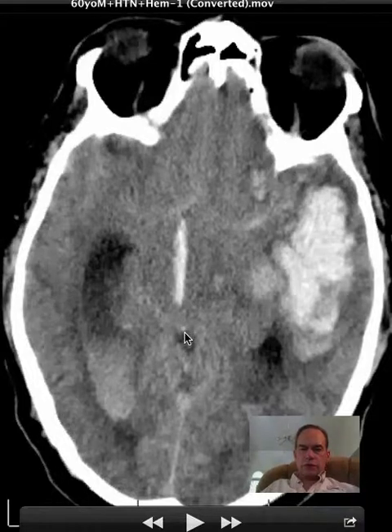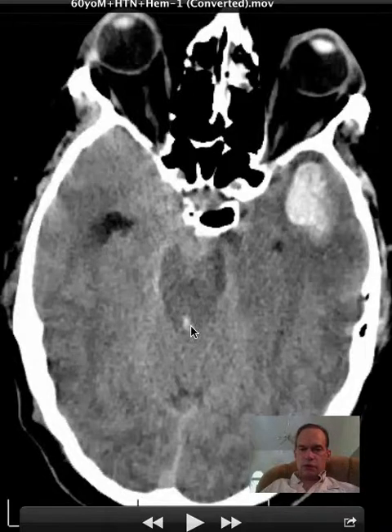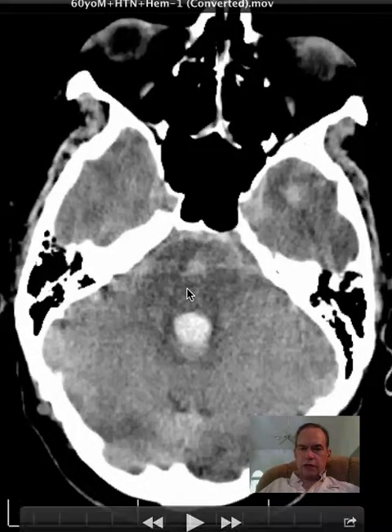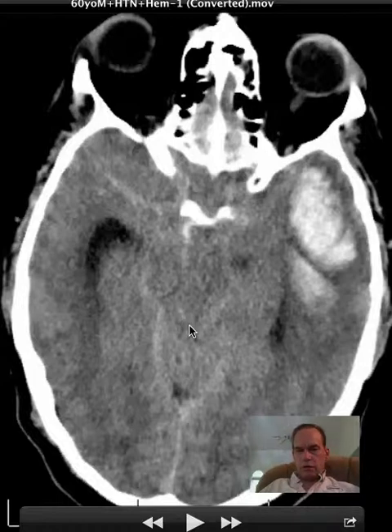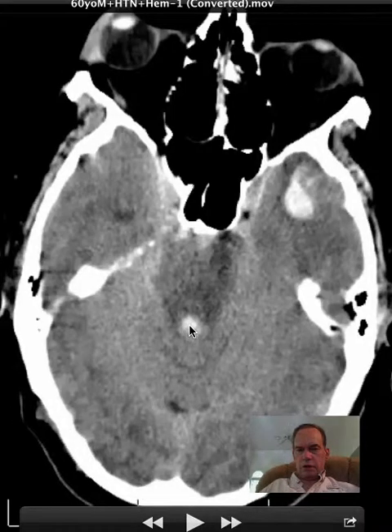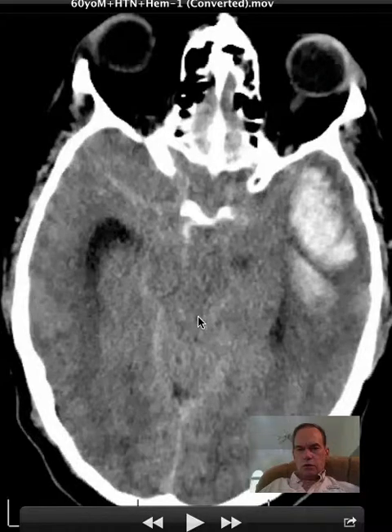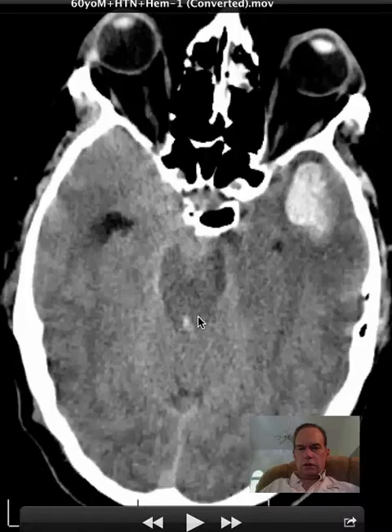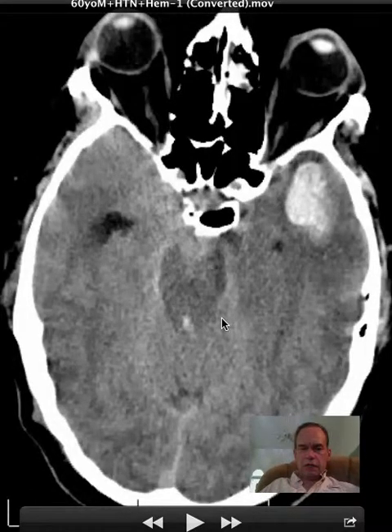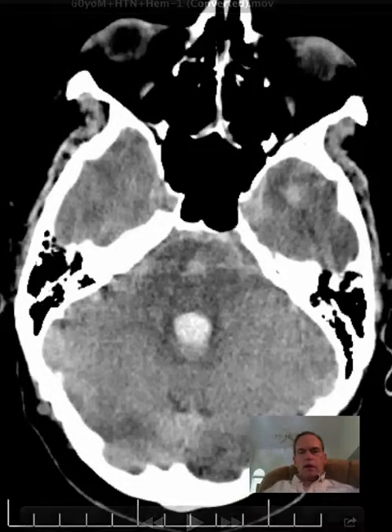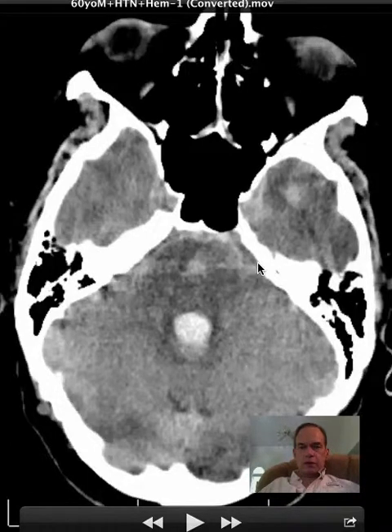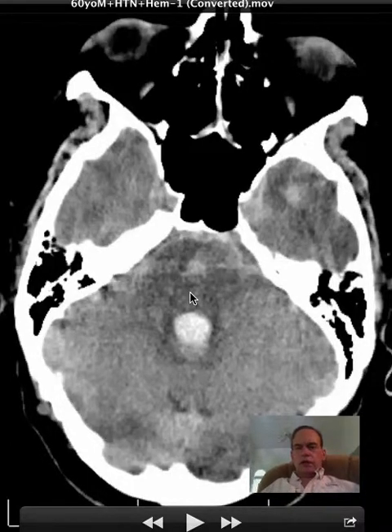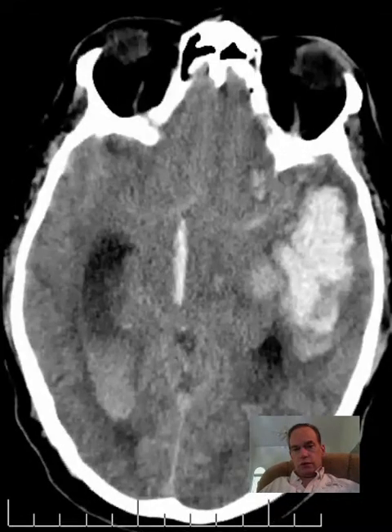Then through the cerebral aqueduct — this is the cerebral aqueduct still, here is the midbrain, and here are the cerebral peduncles. Going down a little farther, you can see the cerebral aqueduct, which you can barely make out. There it is — here's the cerebral aqueduct. Going posteriorly and inferiorly a bit more, you see the fourth ventricle. The fourth ventricle doesn't look too bad because most of the mass effect is supratentorial. The tentorium separates the posterior fossa from the supratentorial structures — both cerebral hemispheres.